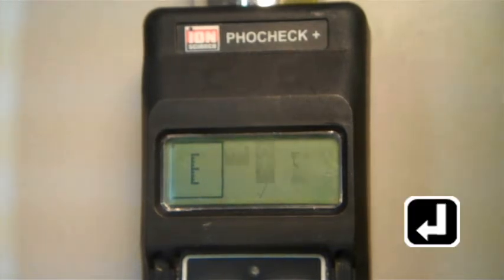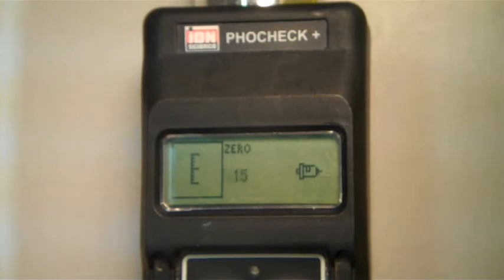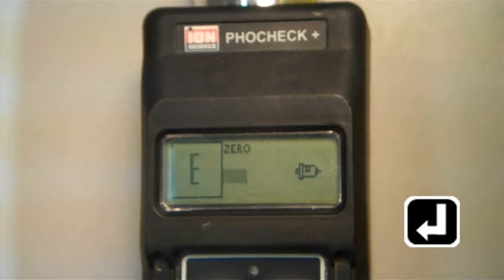You should see a blinking cursor over the word zero. If not, use the arrow buttons until you see this, then press enter. Take a moment to make sure that you are in a clean, fresh air environment. Then press enter to begin the zero calibration.